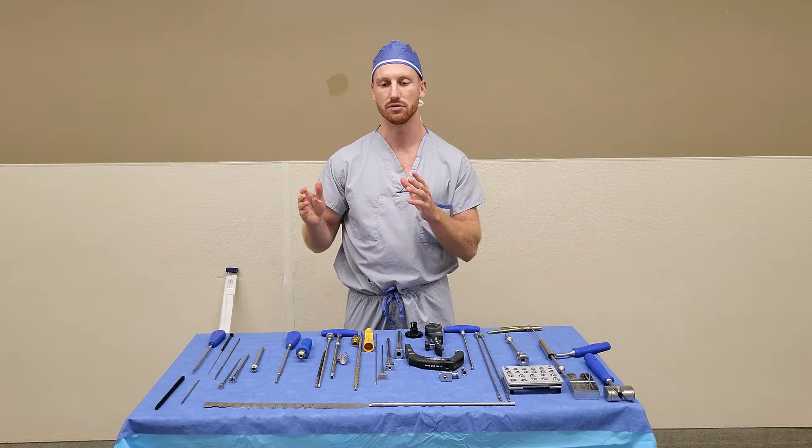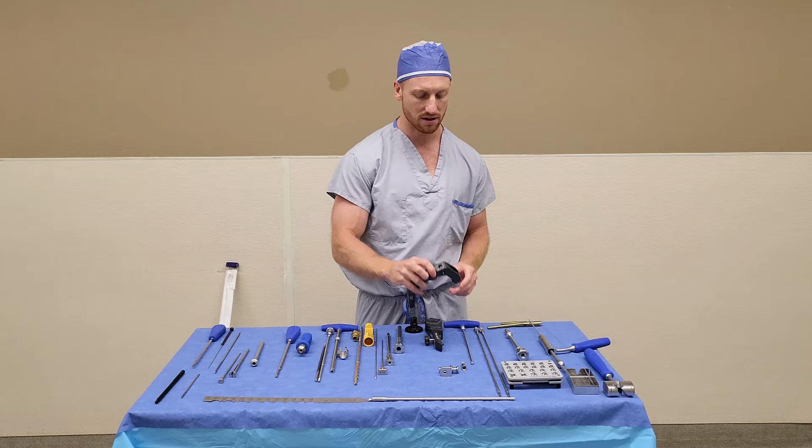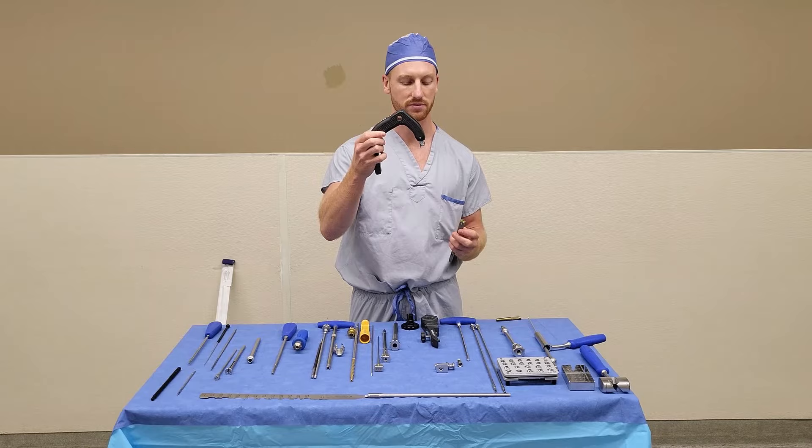For the purposes of this demonstration, we will move to a shorter nail. When you do a short nail, you do not need to ream. So after the entry reaming, we would move right to assembling the nail. To assemble the nail, you open your nail and you grab your handle.